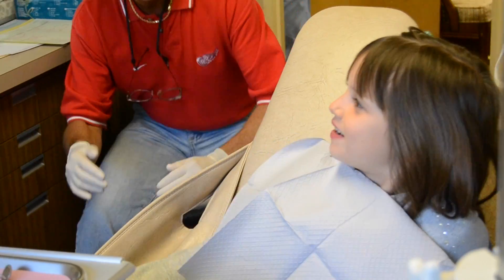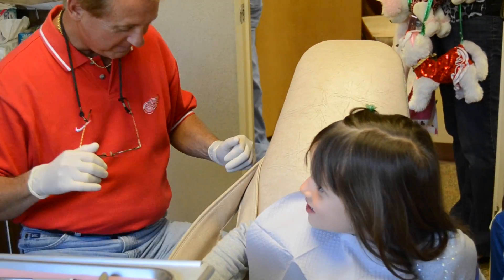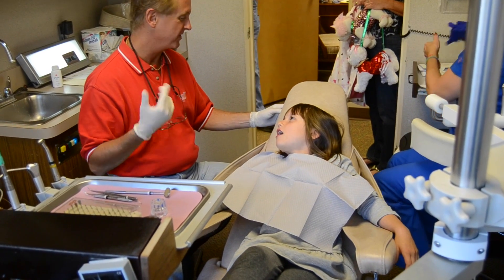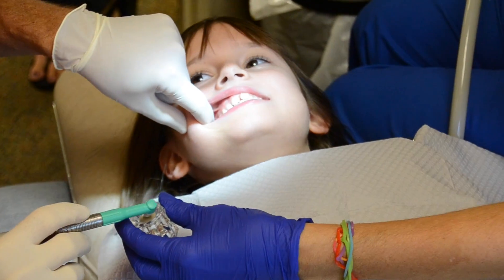I need to close my mouth every five seconds. No, not every five seconds — you're going to keep your mouth open. Rest your head back. How long? Well, we're going to see. First thing I'm going to do is clean off the teeth. It's just like when you have your teeth cleaned. We're just going to take this and free out the grooves of your teeth.